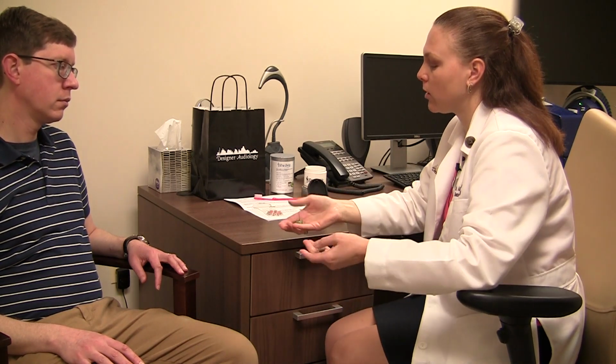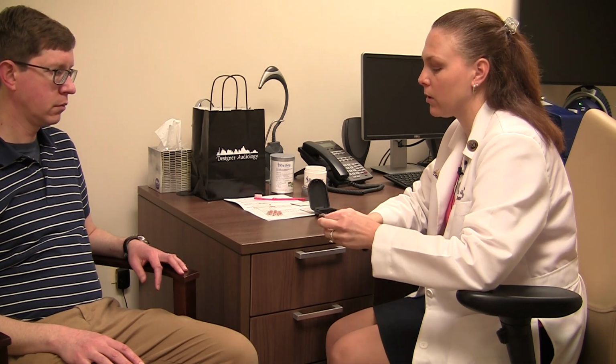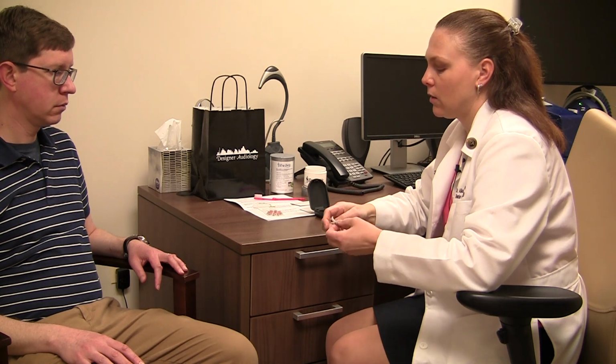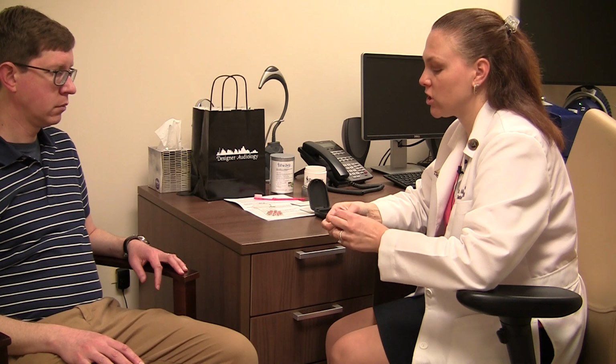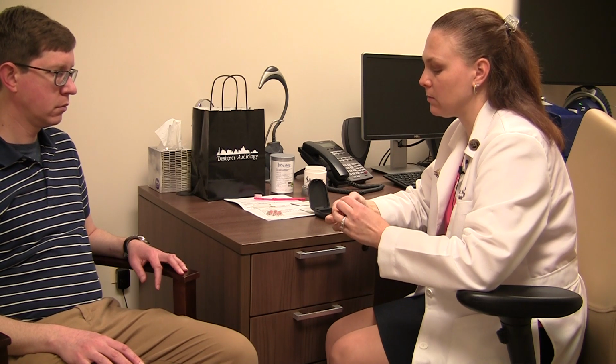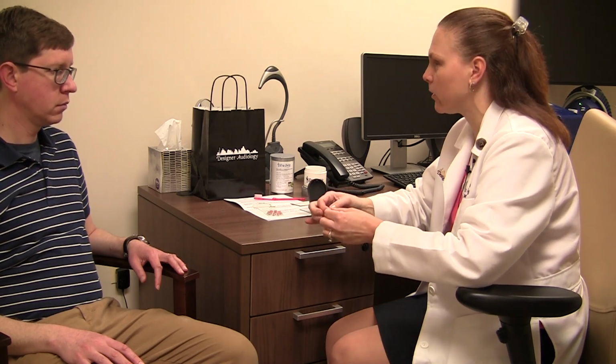First thing, here's your hearing aid itself. There are two parts to it. The part that's custom made that goes in your ear, and then the part with the computer chip that sits behind your ear. It's going to be connected by this soft flexible tube, and we're going to change that periodically when you come see me. But if that tubing ever falls apart from the hook, just push it right back together. It shouldn't come apart. You saw me put it together, but just in case, you push it back on.